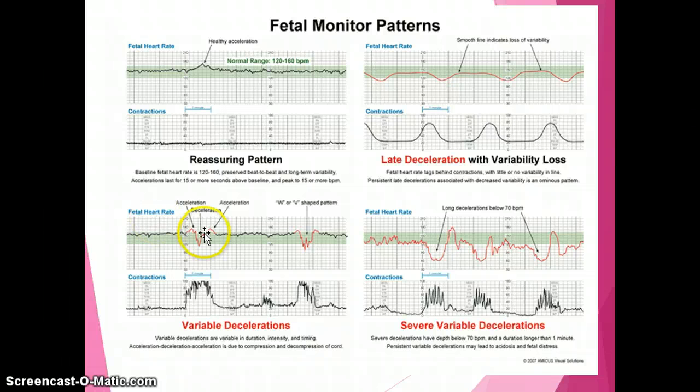When you see persistent late decelerations and decreased variability, it's very ominous — not great outcomes are associated with that. With variable decelerations, you still have variability bouncing up and down, but then you see these decelerations that are variable in duration, intensity, and timing. You'll see an acceleration, then a deceleration, then an acceleration — typically associated with cord compression or decompression of the baby's umbilical cord. You'll also see little bumps called shouldering on either side of the deceleration, like shoulders.